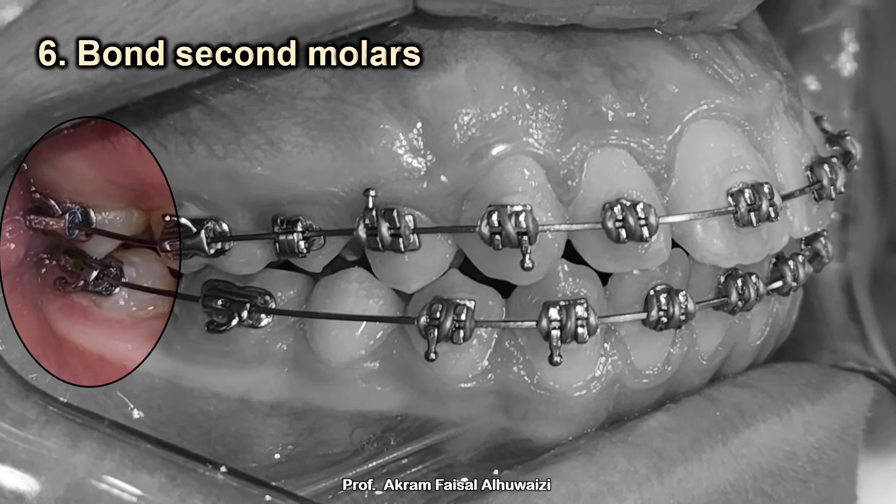Tip number six: since you're going to retract the anterior teeth, always bond the sevens — they increase anchorage during retraction of the anterior teeth. There is however a problem in open bite cases: bonding the sevens causes their extrusion, which opens the bite anteriorly. So in an open bite or very minimal overbite case, I wouldn't bond the sevens and would use TADs for anchorage instead. In a deep bite or normal overbite case, I'd always bond the sevens.